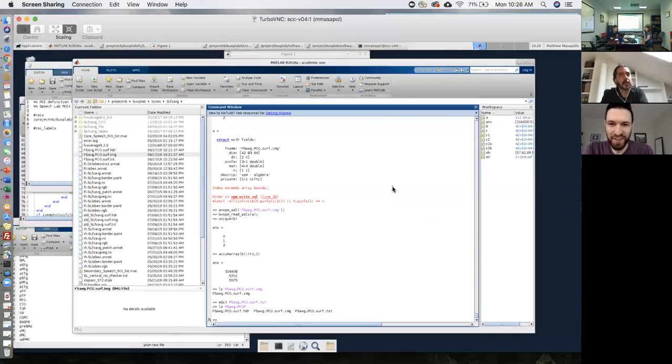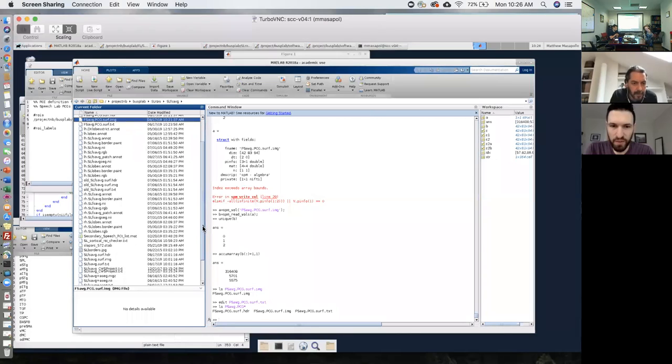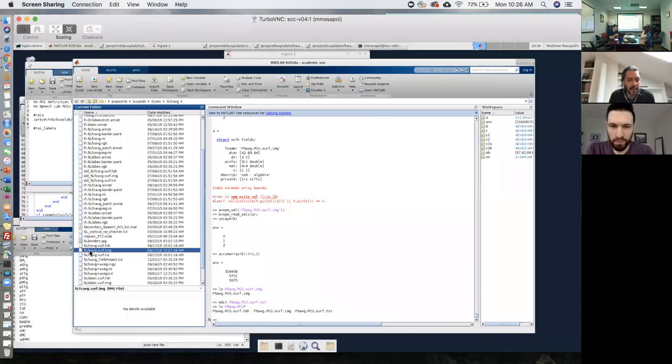Let me see. What is the way that we decided? First we want to identify the file that we care about, which is this LH SLFS average annotation file, and we don't want to work with the annotation file because it's hard. So we figure out which one is the corresponding NIfTI file, and the corresponding NIfTI file is this one that is called FS. What is it? It should be here. Right. This one. This is the file that we care about. And this file contains all of the regions that we care about, and these were a few hundred, right?